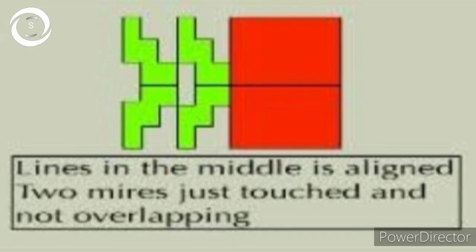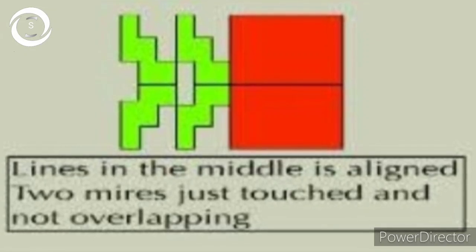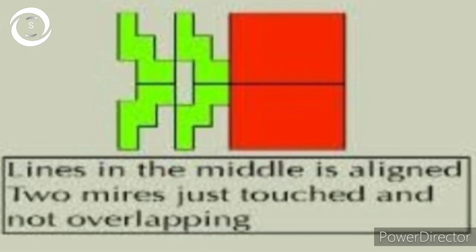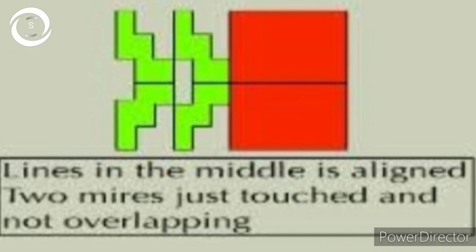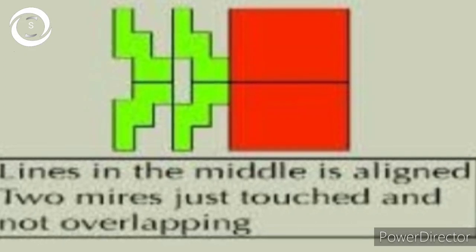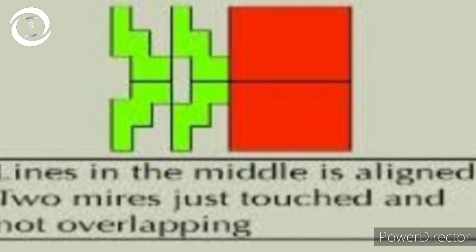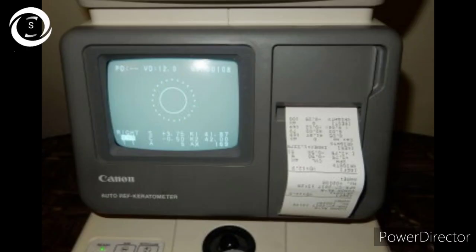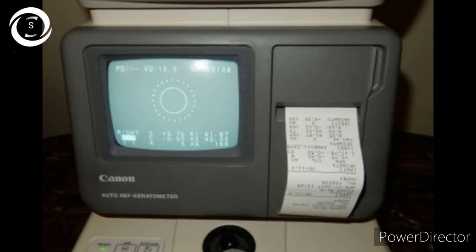Here, the line in the middle is aligned, the two mires are just touched and not overlapping, so that will give you correct readings. Take note of that reading, then move the machine perpendicularly, again align the mires, and take the other axis reading as well. That's how you use Javal-Schiotz.